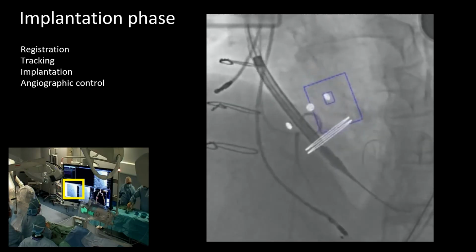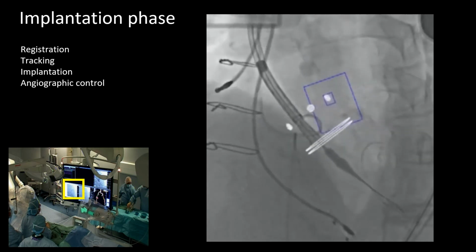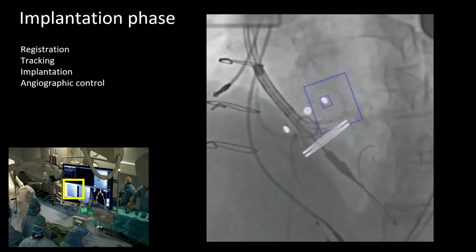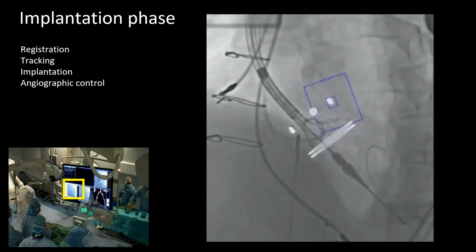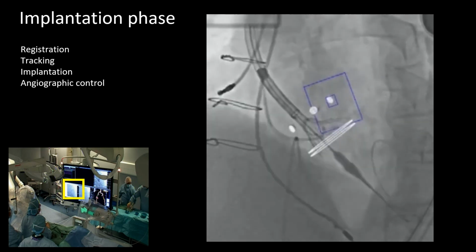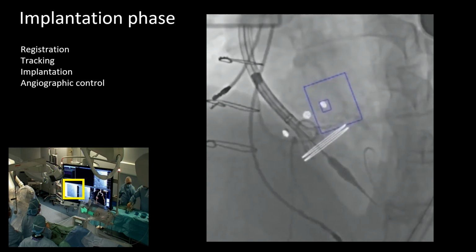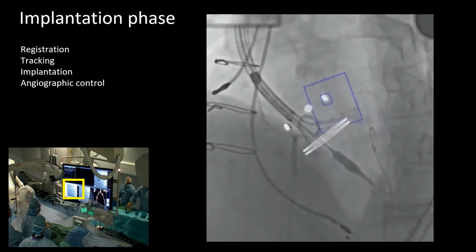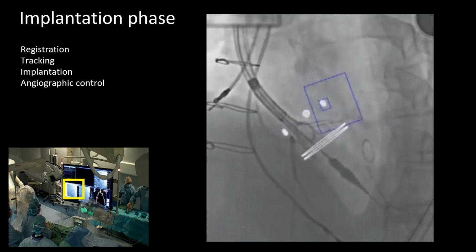Finally, this is the augmented fluoroscopic view demonstrating the surface mesh alongside the optimal implantation level superimposed on the fluoroscopic image. The transcatheter heart valve is implanted while maintained alongside the optimal implantation plane. This plane is crucial for both clinical and technical outcomes.